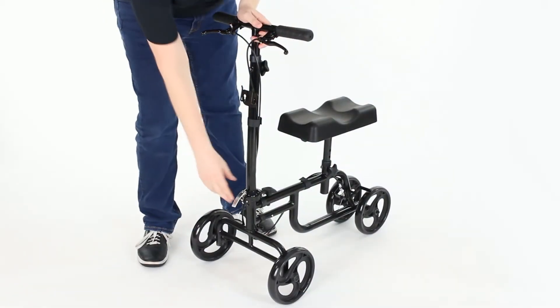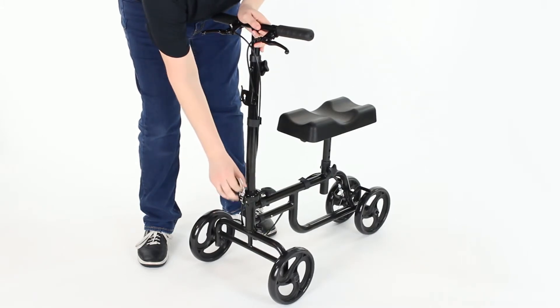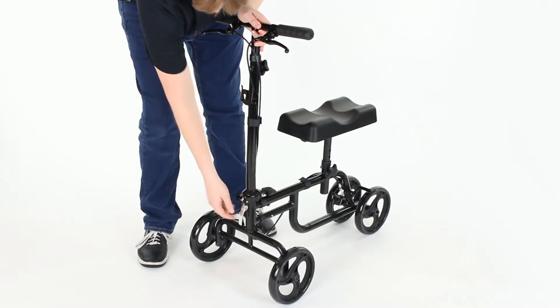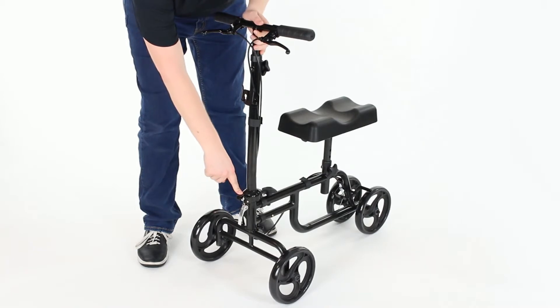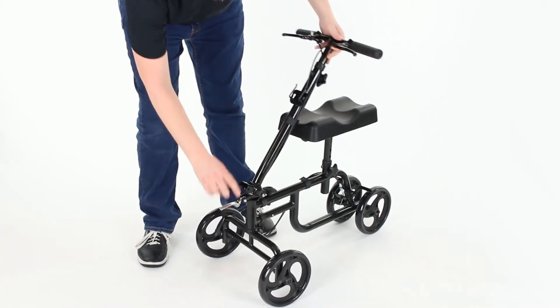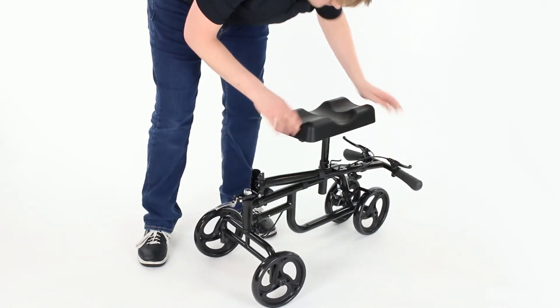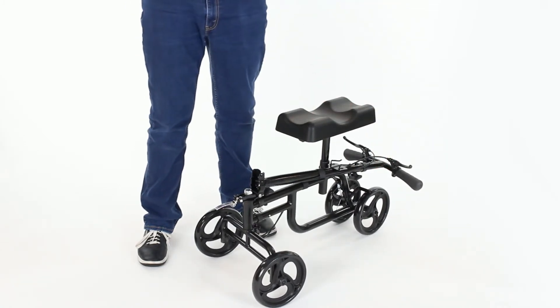To fold the knee walker: first disengage the tension lever at the tension lock and lower the tension lever assembly down to release the tension on the hinge. Then pull the locking pin aside to free the hinge and fold the handlebars under the seat. The seat can also be removed if you wish.